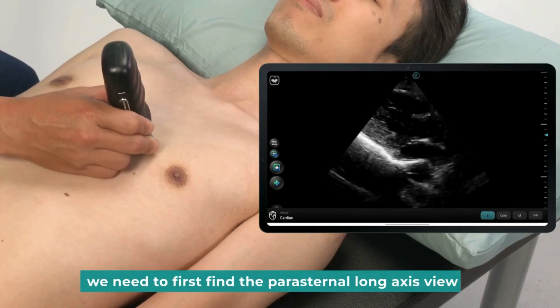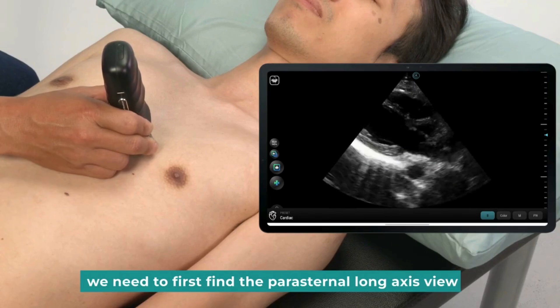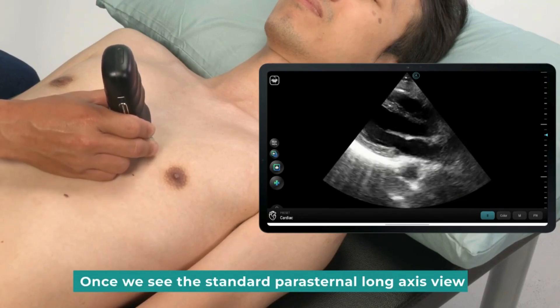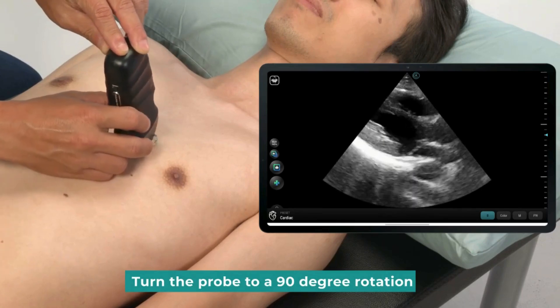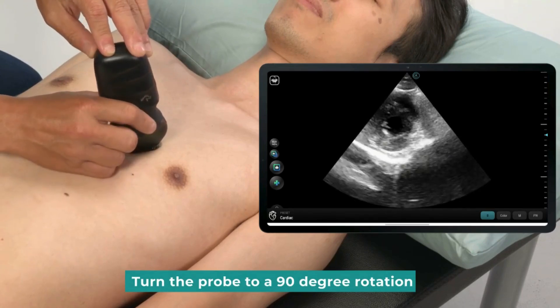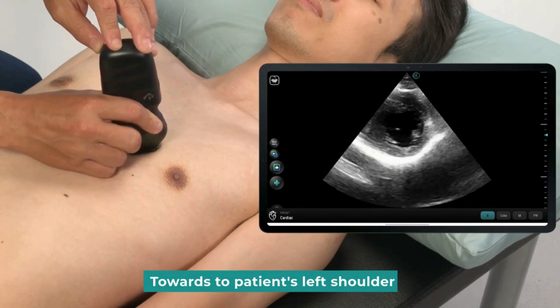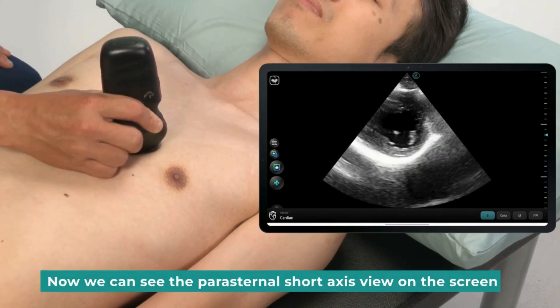We need to first find the Parasternal Long Axis View. Once we see the standard Parasternal Long Axis View, turn the probe 90 degrees towards the patient's left shoulder. Now we can see the Parasternal Short Axis View on the screen.